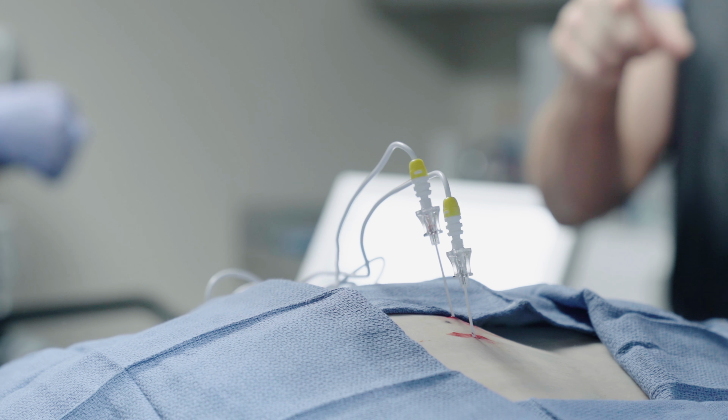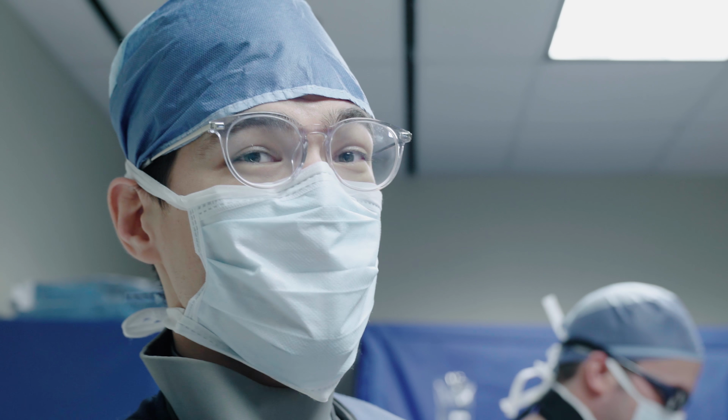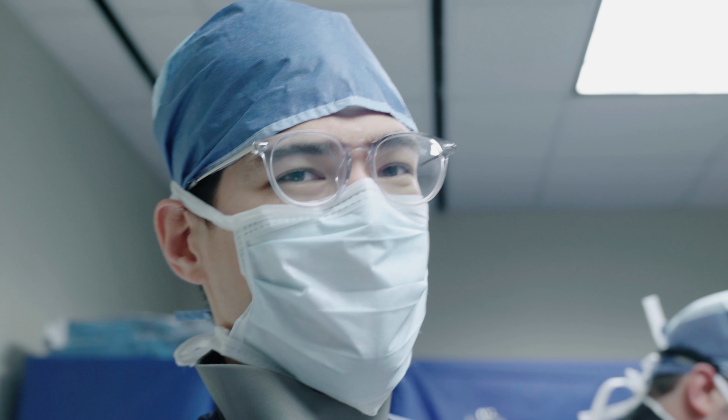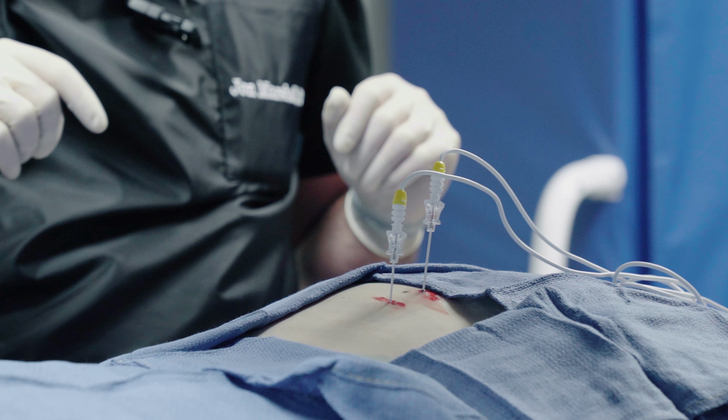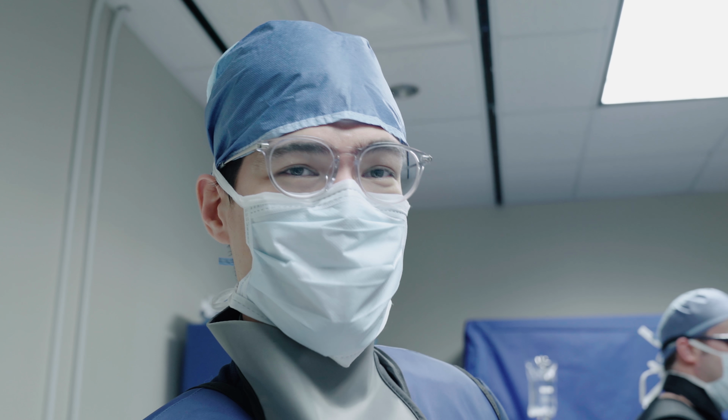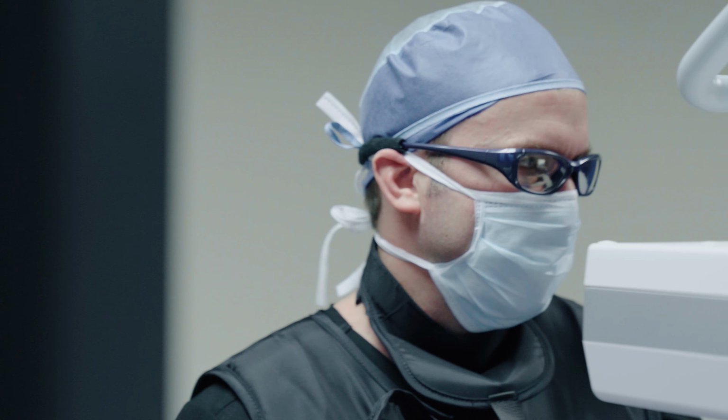We've tested and made sure that there's not going to be any problems with the motor nerves that supply the legs. That's obviously one of the more serious complications. You don't want to ablate a nerve that causes decreased function of the legs. We just want to ablate the nerves that cause pain to the back. Tested all that, everything looks good. Now we're doing the ablation here, you can see on the machine. 45 seconds, you're all done.